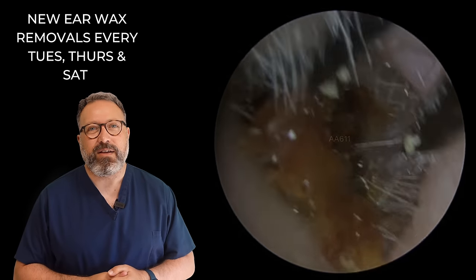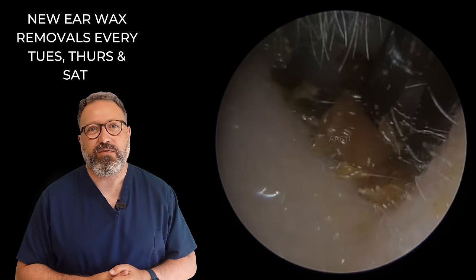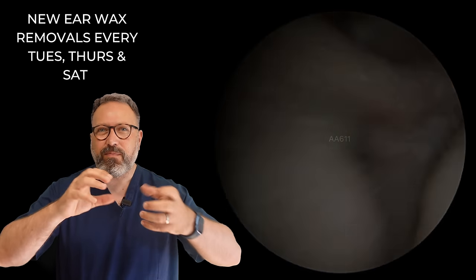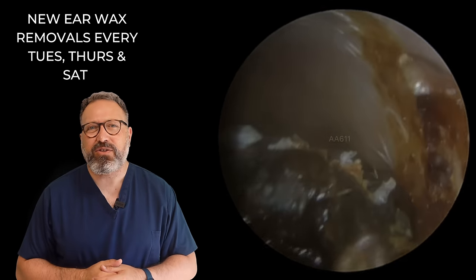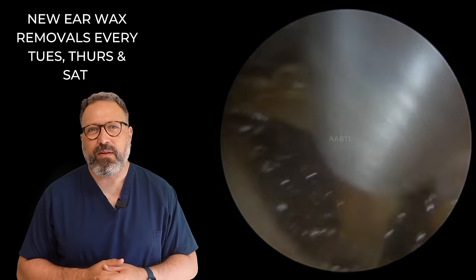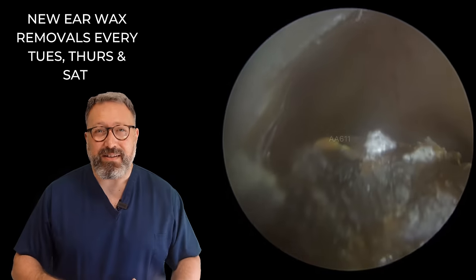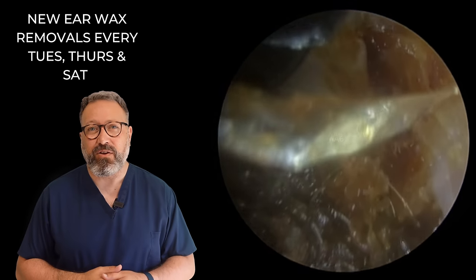Let's see if we can get to this next section — it's working quite well so far, so we'll stick with the forceps. You can see that wiggling motion come into play there, raveling and teasing this wax out. But now this next section is not going to work particularly well with the crocodile forceps. So I'm just trying to lift this last section, but this last section is welded to the canal wall. I'm going to bring the St. Bart's Hook in at this point — let's see if this does any good for us.